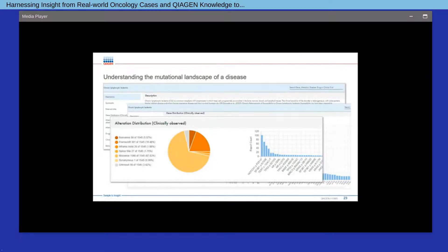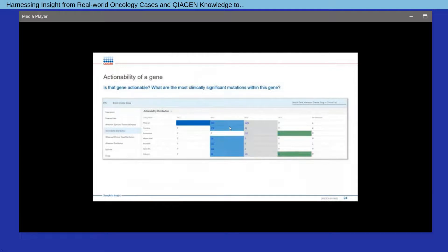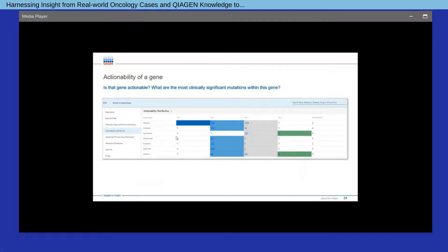After determining that BTK is not one of the top 10 mutated genes in CLL, you may wonder how actionable this gene actually is. What are the most clinically significant mutations within BTK? HSMD provides for each variant an actionability classification based on the AMP guidelines, which determines the therapeutic, prognostic, or diagnostic importance of a variant. We can plot the actionability across different alteration types, giving an overall assessment of how actionable a gene is, and whether actionability is driven by a small or large number of variants in a specific alteration type.